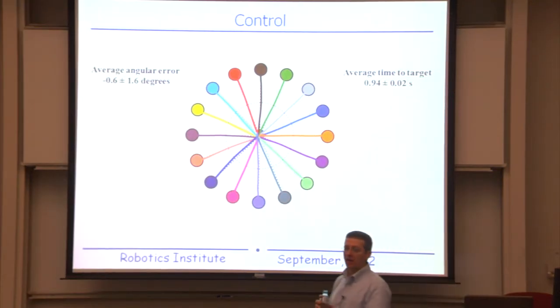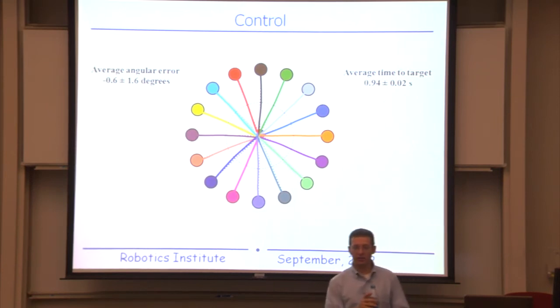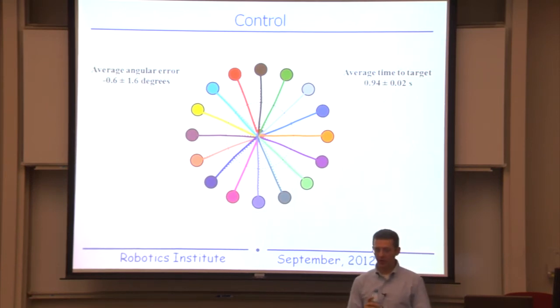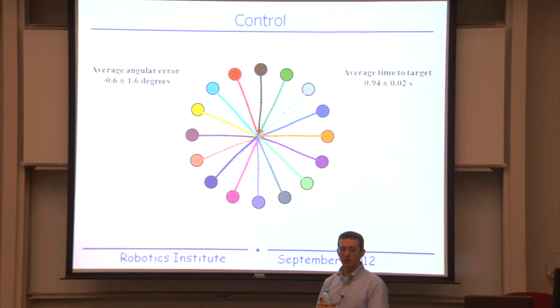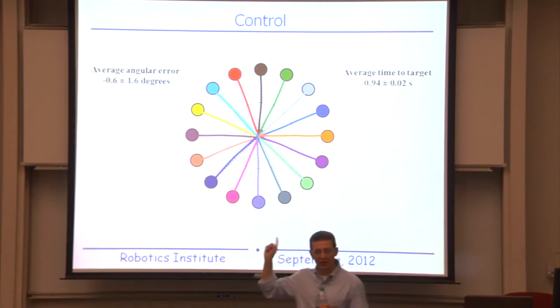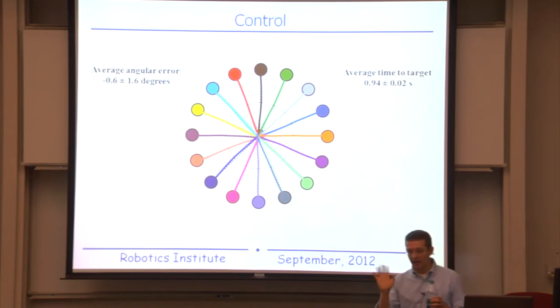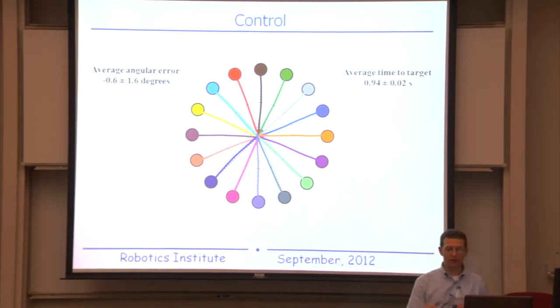So this is just the average trajectories from all the experiments in which we took 50% of the neurons and rotated them by 60 degrees. And you'll notice that those average trajectories point pretty straight to the target, and we can assess the error in the movement, the angular error, by looking at the angular deviation from a straight line to the target at the halfway point, at that dotted circle. And so in the control session, that average angular error is very close to 0 degrees, and the average time to target is a little bit less than a second.